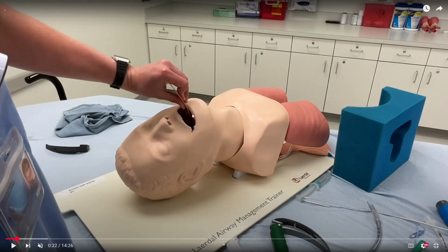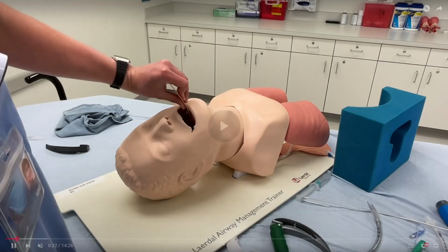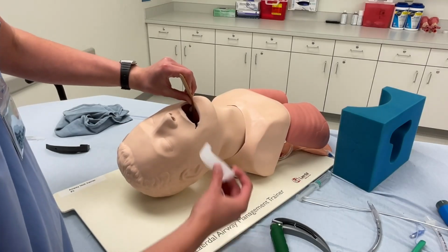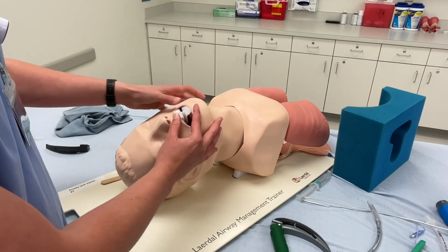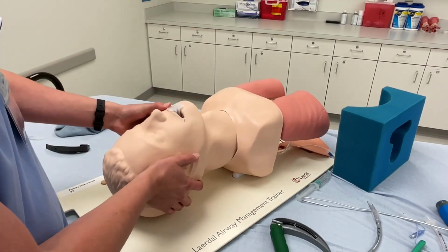I mean, they do have tongues, but they're not floppy tongues like they would be in a real person. So, using the tongue depressor is slightly overkill. However, on a real patient, it's often advised that you do this, and I believe it is actually the textbook way of going about it. So, using the tongue depressor to get out of the way, inserting in one fluid motion, and that's going to help open up this fake patient's airway.